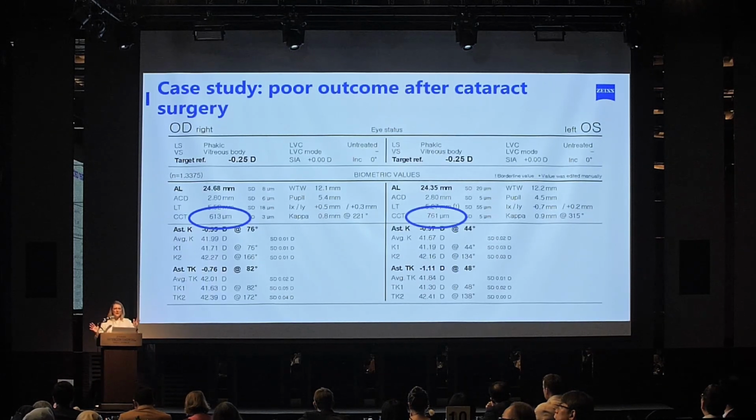So this was all there beforehand, but there is so much information for us to synthesise in that first visit. Of course, we're going to miss some numbers here. So this is really an opportunity for AI to be able to tease out these things. We get a warning if axial length is different, but we don't get a warning for this. And there can only be so many warnings. I think in the last presentation we saw a whole block of text with all the many warnings for an atypical eye. I think if there's too many warnings, we perhaps don't pay attention.